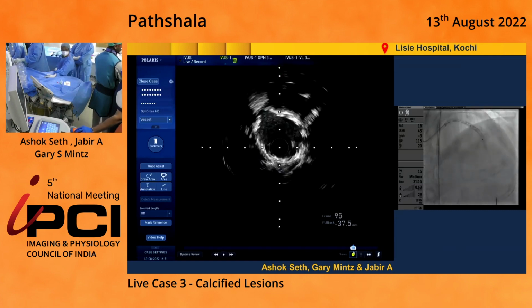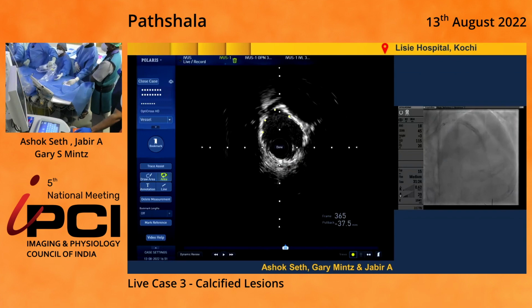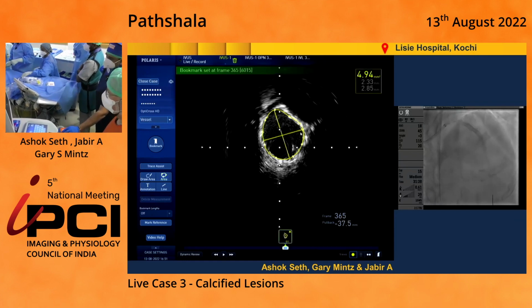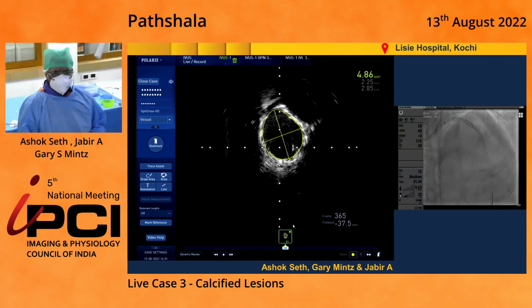I mean, Ziad, some of the calcium thickness was easily over 1 millimeter. Yeah, easily. So that's where Darshan and I were just talking about what the utility of laser would be here. Yeah, what would it be? Would we be able to?